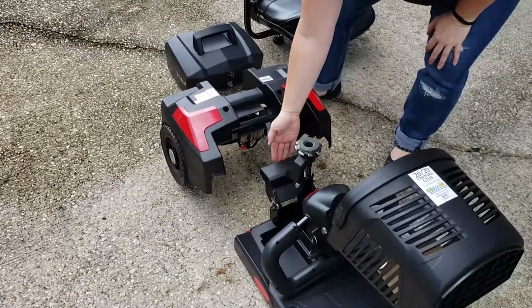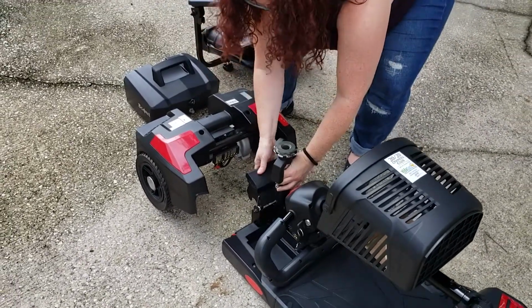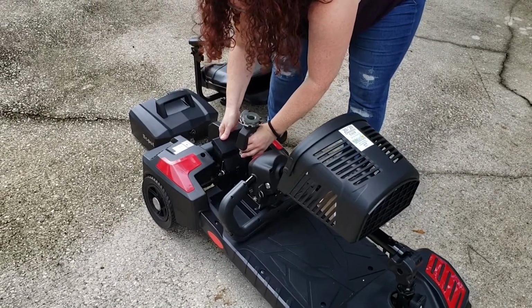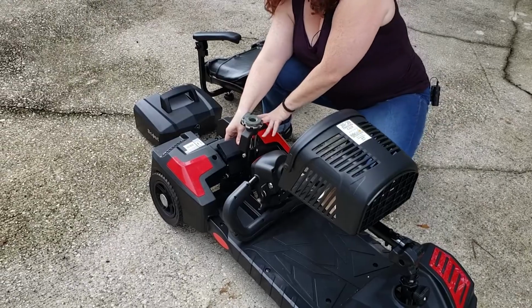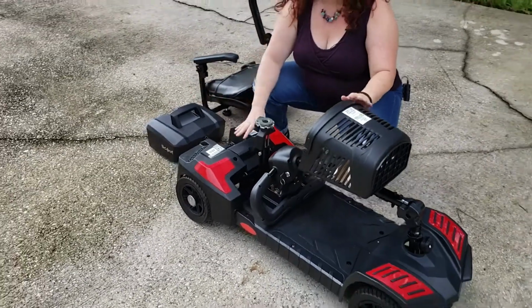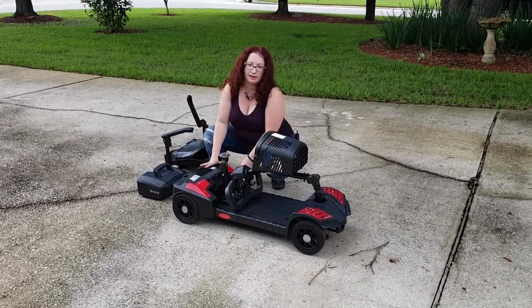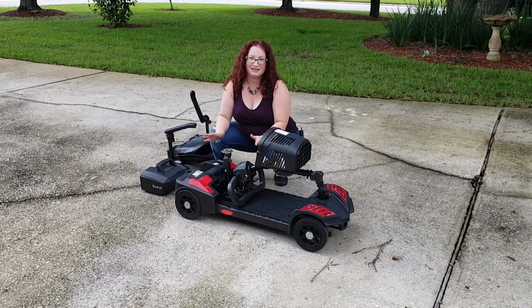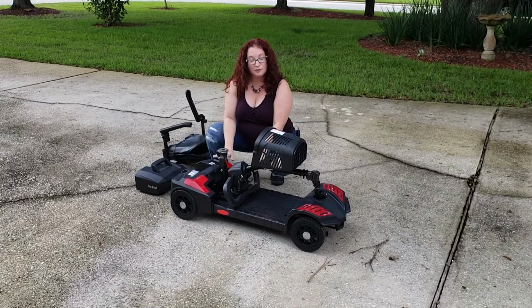So let's see, I'm just going to pick this up here. You can use the seat post if it's easier, or you can use the handle, or both. I'm going to align those red marks, and I have to lift the section up so that it sets into the curves there. You can see when the 2 parts go together, the rear section tilts forward and it comes together, and then that handle just snaps into place. If the handle is not snapping into place, do not force it. It means that you need to slightly wiggle the back wheels so that it aligns. It will come together that easily if it is properly aligned. So don't force it.